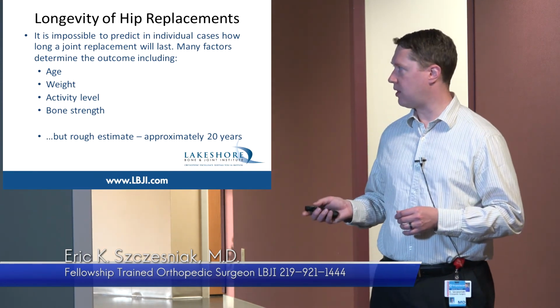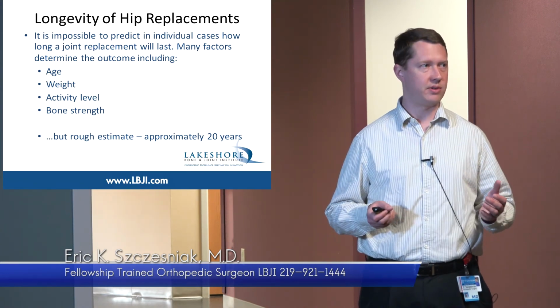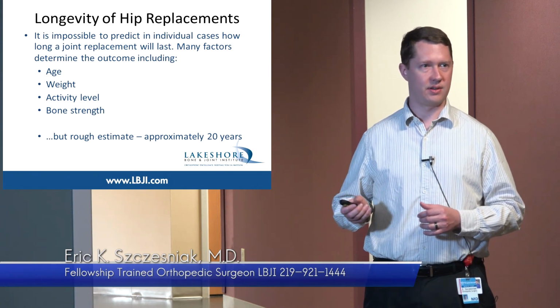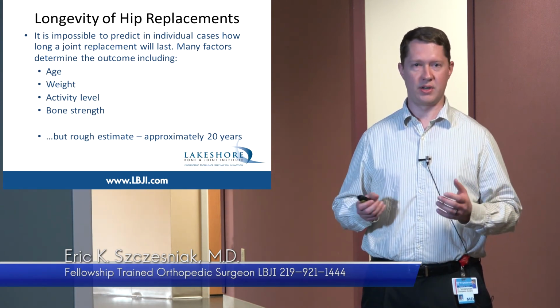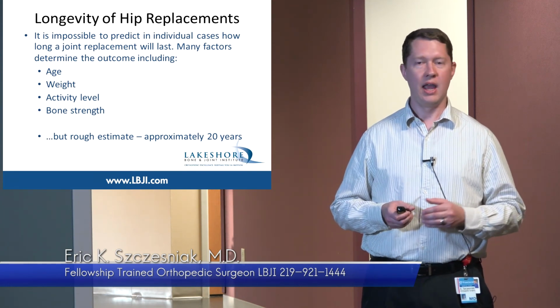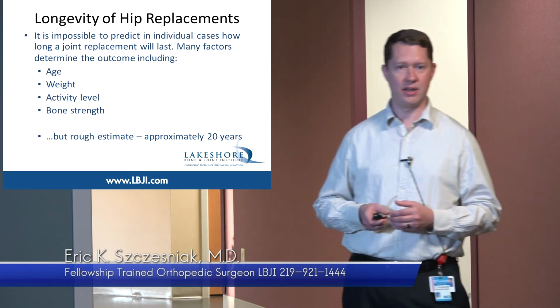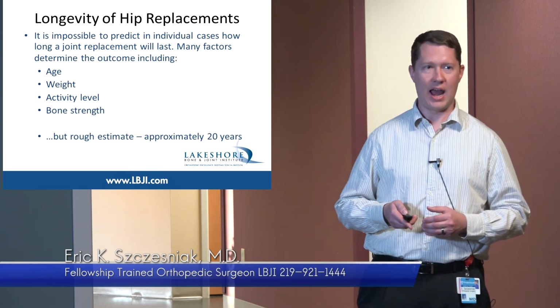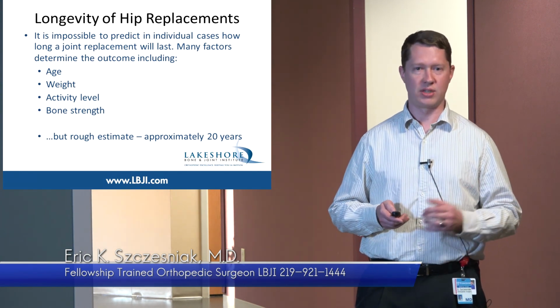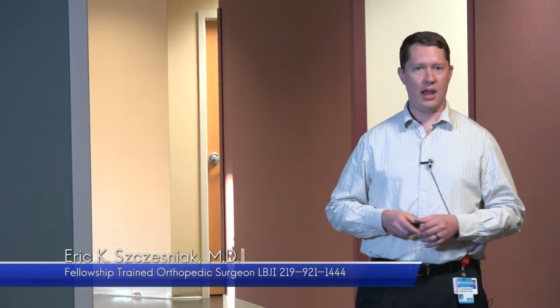The other thing with the 20 years is, in general, when we say 20 years, people think that's an average, that only half of hip replacements are left around. For whatever reason, the way we came up with this as a community, as orthopedic surgeons, we decided to say whenever there's only 90% of hip replacements, they're still functioning well. And so at 20 years, 89% of hip replacements are still in place and functioning well. So it's not an average of, you have a 50% chance of it still being there at 20 years. Most likely at 20 years, your hip replacement will still be working well. Any questions?